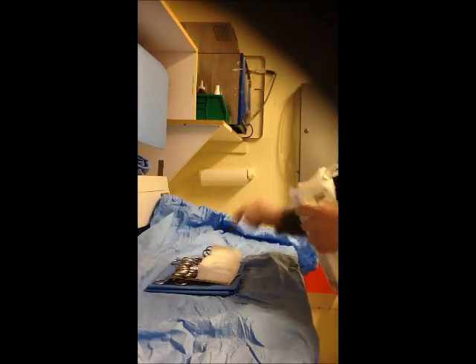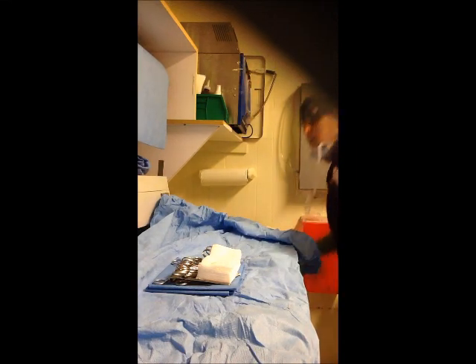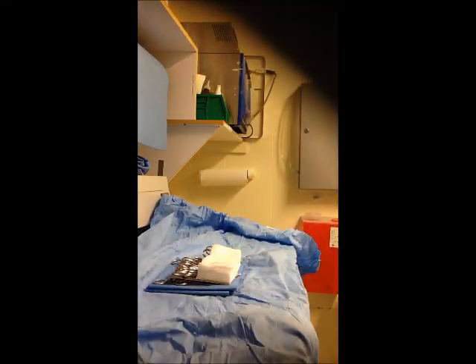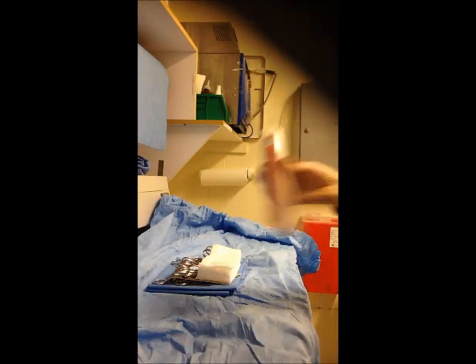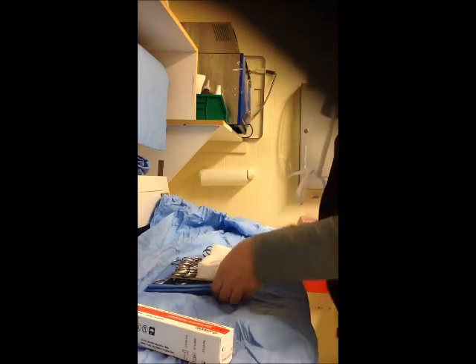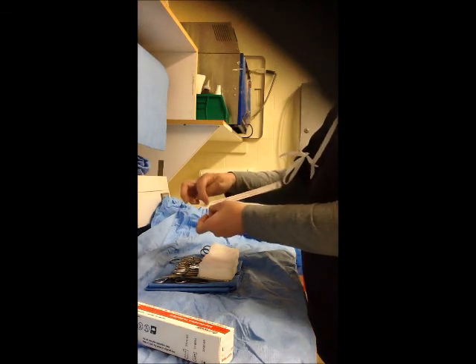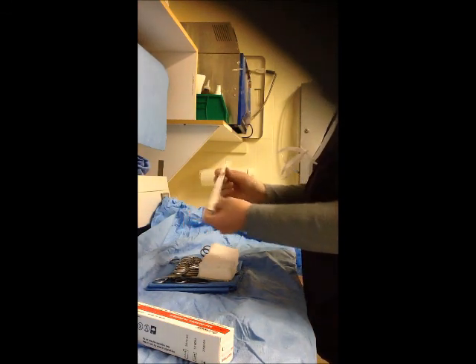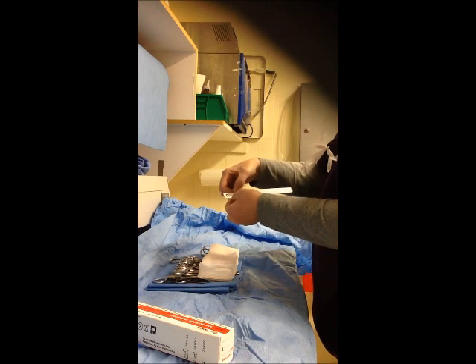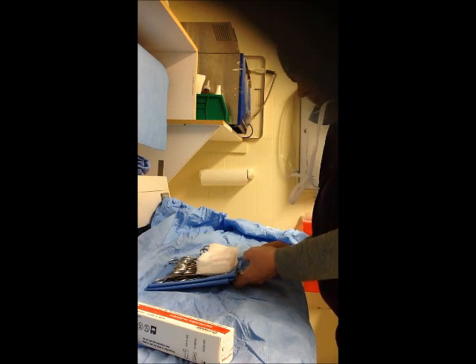We're going to get 2 packs of gauze. And it is also going to get an indicator strip so that the doctor knows once they open the pack. On one side is a dot, there's a dot here that'll color in black, and this one is an O, and the K with an arrow will color in once it is sterilized.